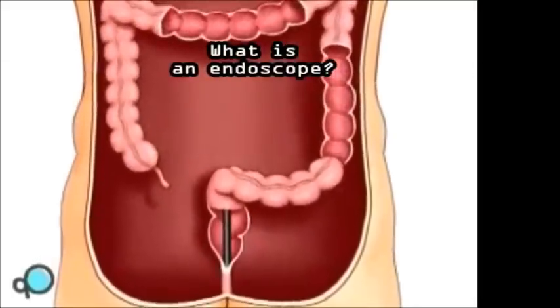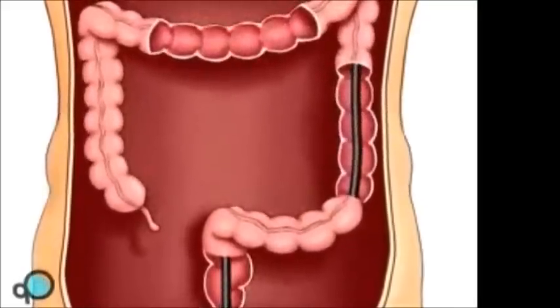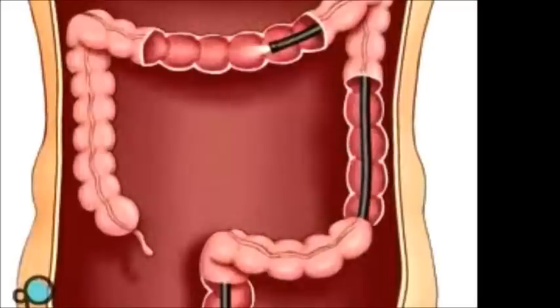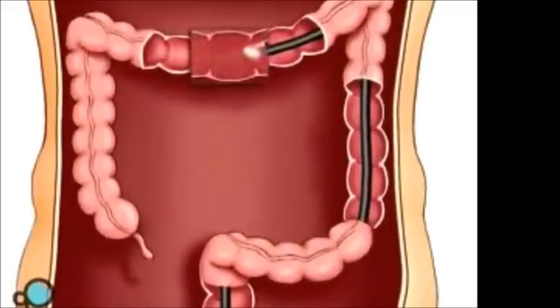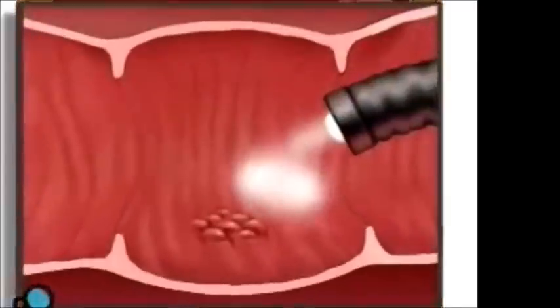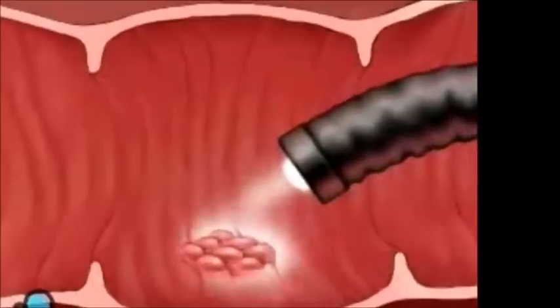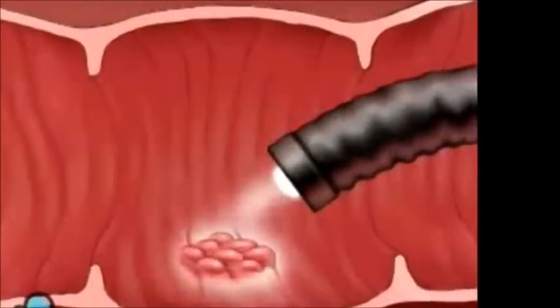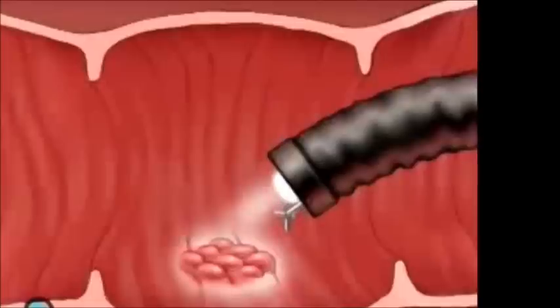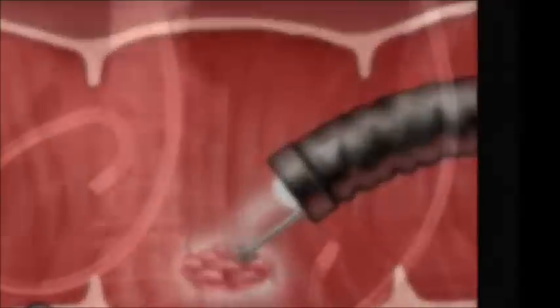An endoscope is a device that consists of a long tube that is inserted into the body. The tube consists of a camera and may include other surgical devices. In conventional endoscopy procedures, doctors guide the endoscope based on the images being fed from the endoscope camera. Due to this, they rely heavily on their skill and judgment in moving the endoscope inside the body, since they do not know the exact location and spatial configuration of the endoscope.